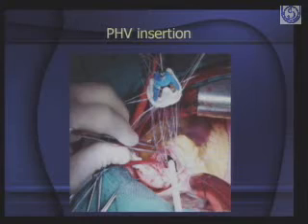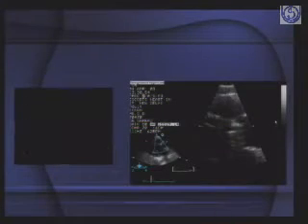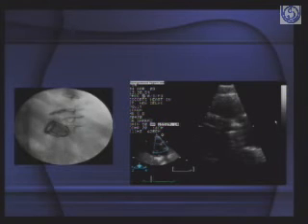And this is just a picture of a prosthetic heart valve during insertion, and Dr. Vinayak really wanted to show you that sometimes we have to resort to good old fluoroscopy when we are looking at LV dysfunction, at valve dysfunction. Now this was not the forum to talk about it, but generally Dr. Jamatia will tell us at some point prosthetic valve assessment by echo also becomes extremely important, because once you have subjected the patient to surgery, he is going to come back to you, and prosthetic valve echocardiography is another topic.